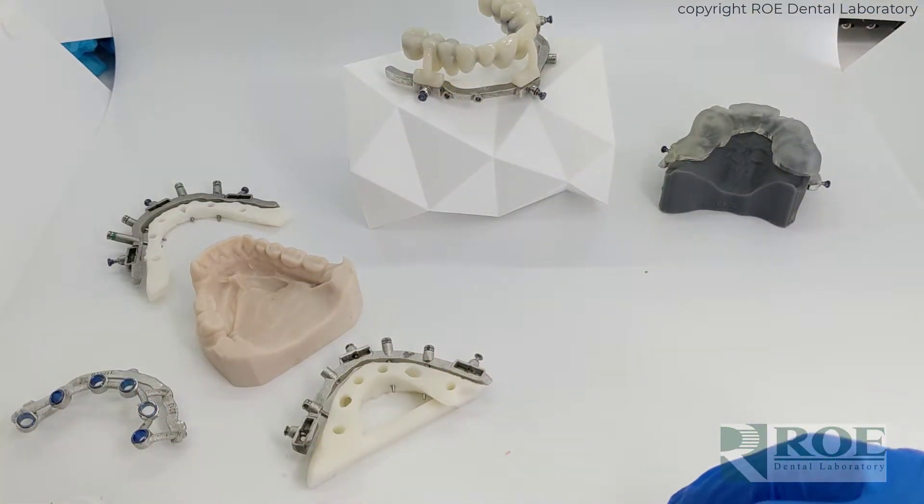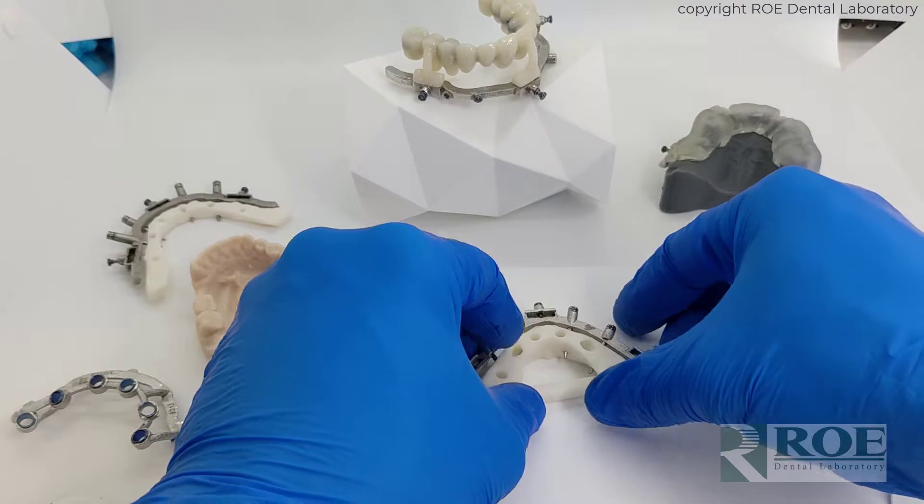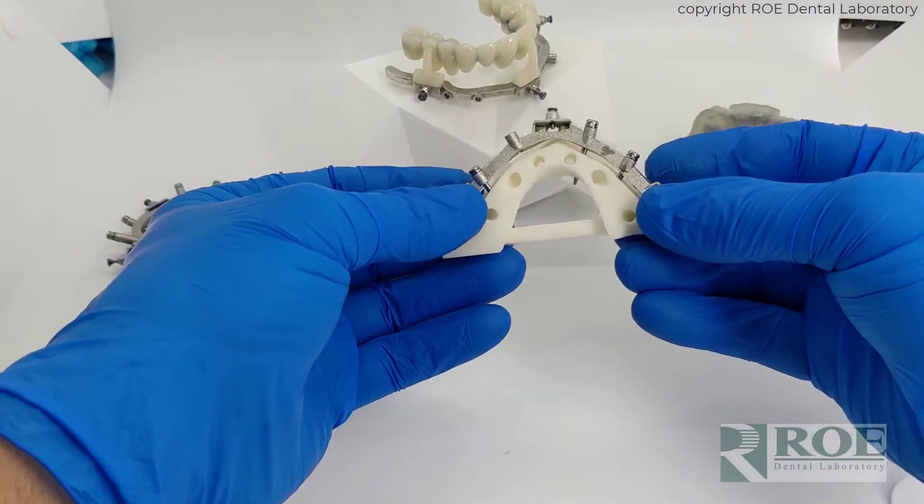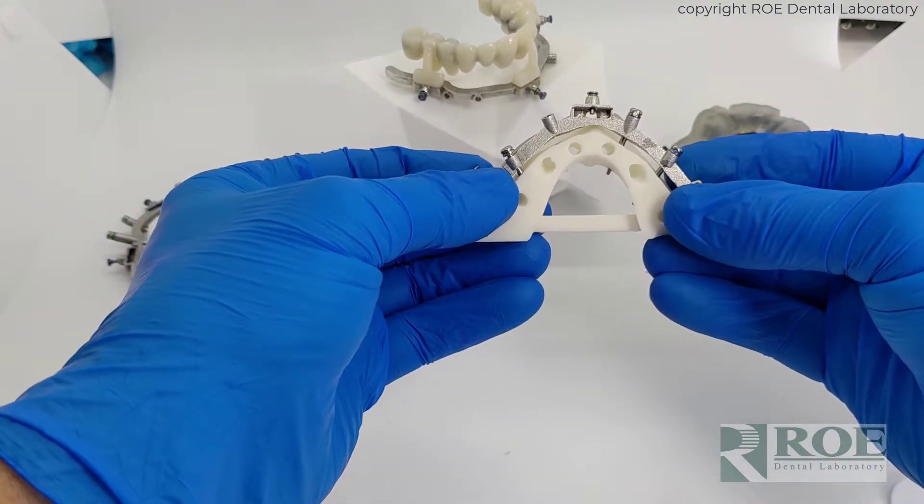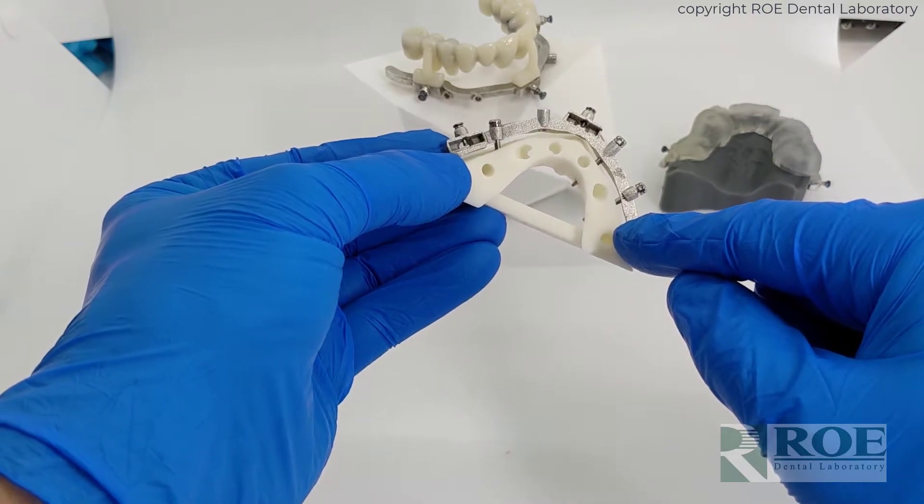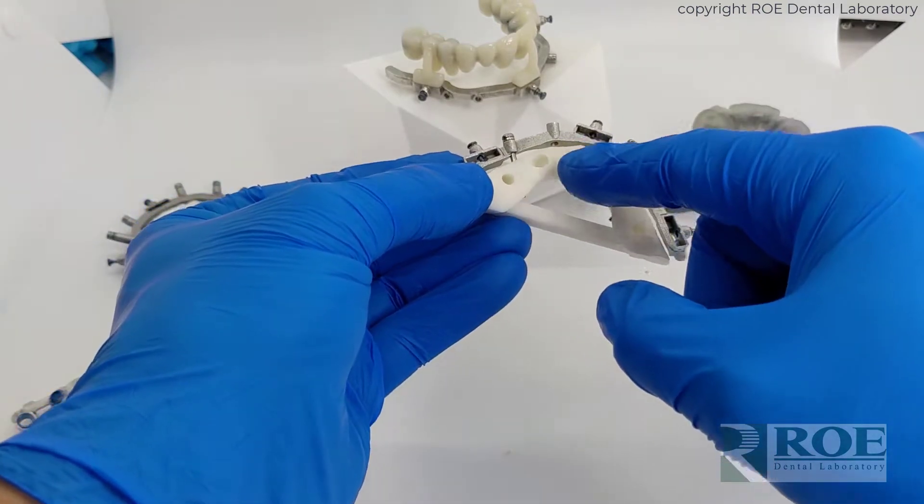Let's move plastic off to the side and show the advantages of why metal guides are far superior. Number one, it's a floating guide system. So it only has a labial aspect, labial buccal aspect, no lingual.